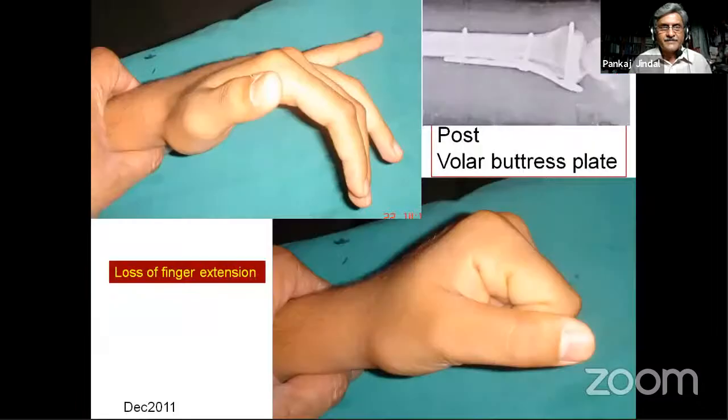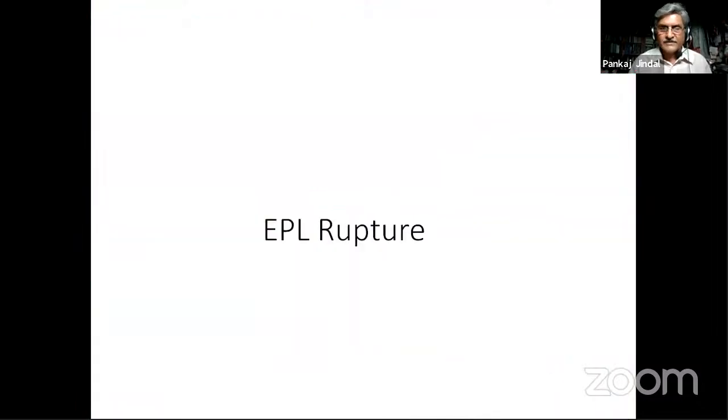Coming to the tendon rupture here, so something has gone wrong. And anyway, tendon rupture is again not uncommon. Yes, it is going down because of the use of thinner plates, but what can possibly cause rupture of the tendon is the drill bits and longer screws, and therefore longer screws are to be avoided. If you are using a volar plate, avoid screws going onto the dorsal cortex, otherwise you can have a problem. And similarly, the drill bits crossing the dorsal cortex can rupture the tendons here.